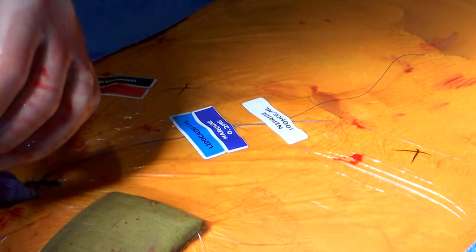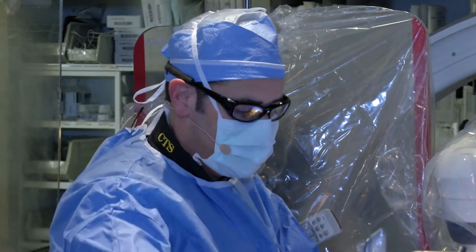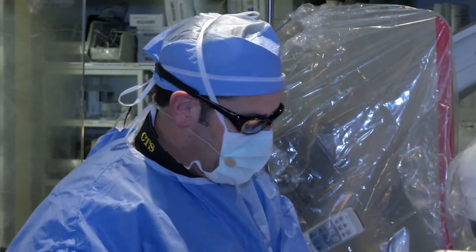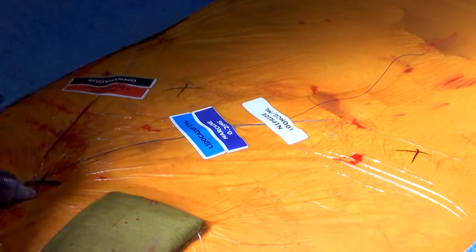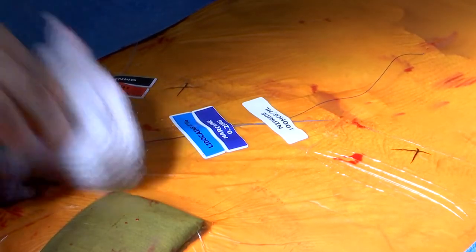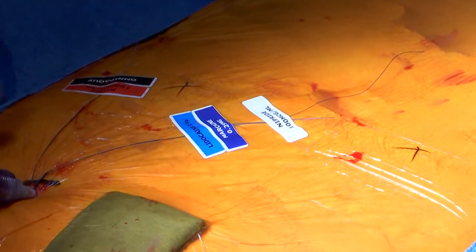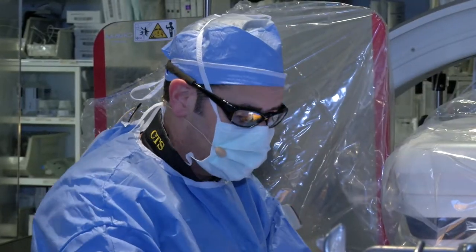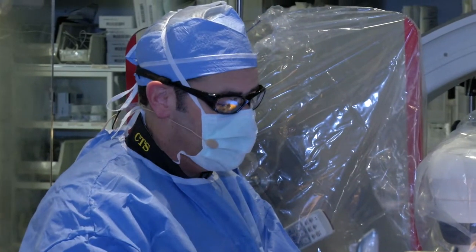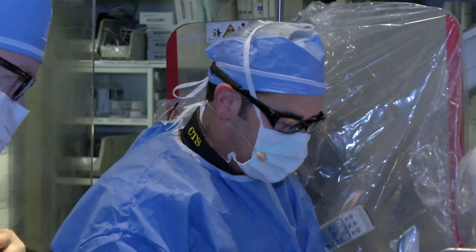And then we're going to suture it in because the sheath is designed to be inserted easily, and so therefore it has a hydrophilic coating, and it's a blessing and a curse. It's a blessing to get it in, but it's a curse later because when we go to advance the valve, the sheath tends to back out because it's so slippery. So we like to suture it in so that we don't have to have that problem. So I'm just going to suture it in, and then that completes access.